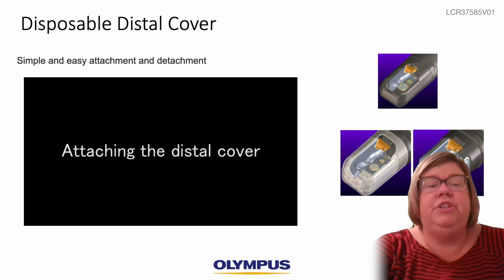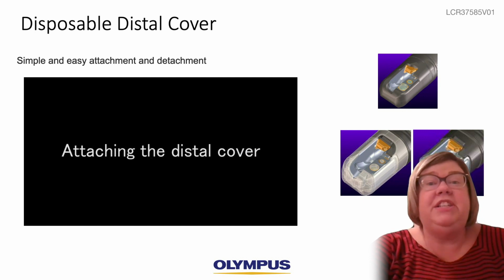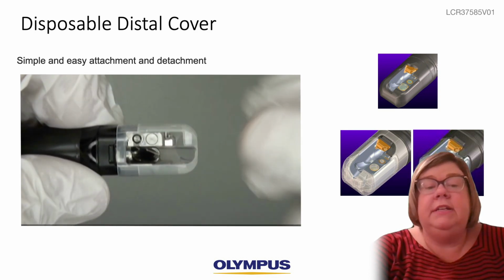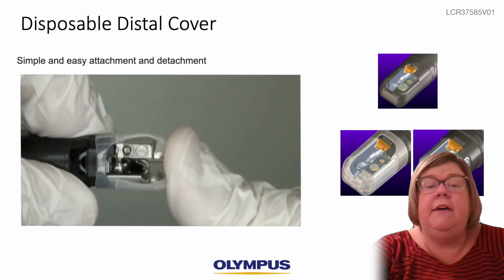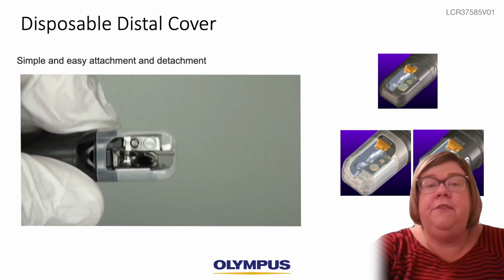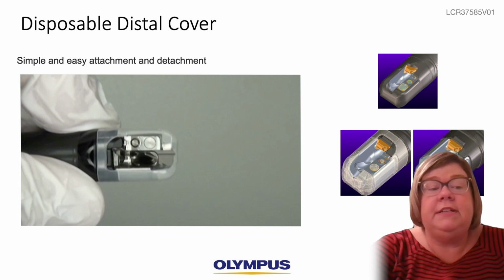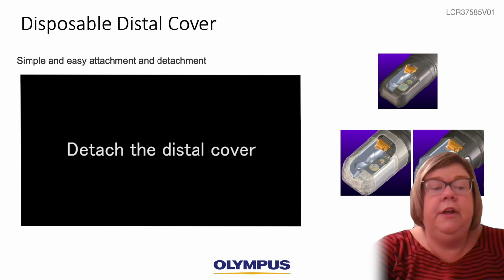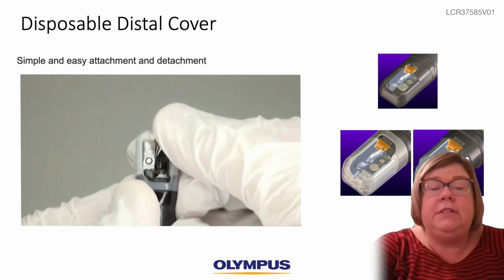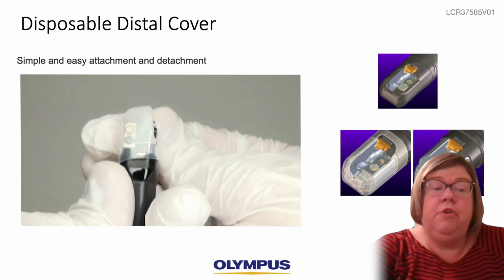I have a video to show you on the attachment and detachment of the distal cap. It is super easy. You simply line up the open side of the distal cover with the lens side of the distal end of the duodenoscope, and you push down until you feel the opening of the distal cover go over the hook of the distal ring on the scope. Then to remove, you tear along the perforated line along the top of the distal cover and twist the distal cover until it is removed from the scope.